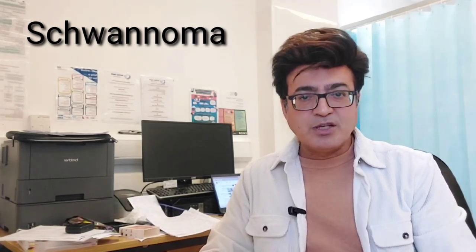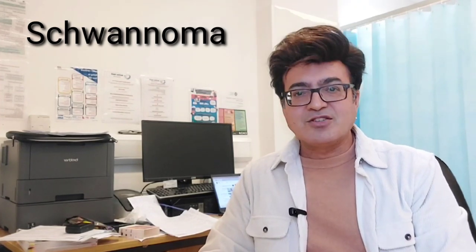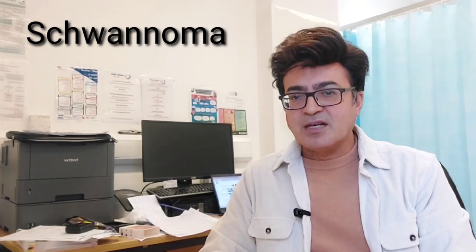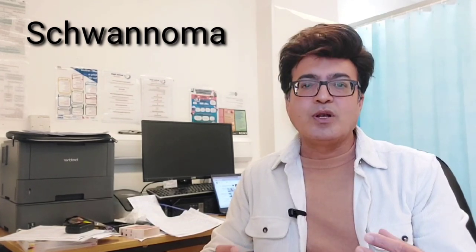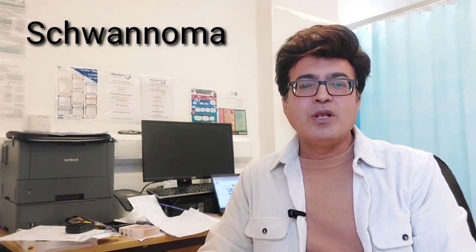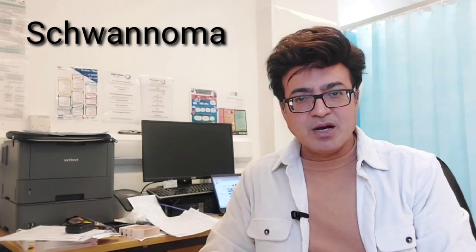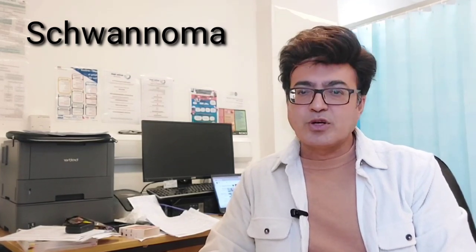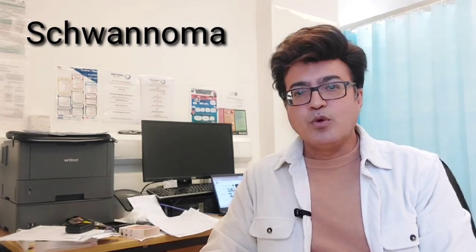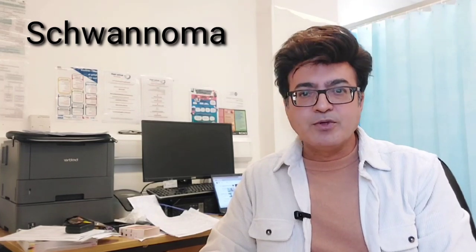And it particularly gives rise to a significant characteristic ice cream shape. The internal auditory meatus will look like a cone, and the main internal tumor will look like the scoop. So it will give rise to an ice cream appearance. Another point worth noting here is that bilateral schwannoma will always be associated with neurofibromatosis type 2.